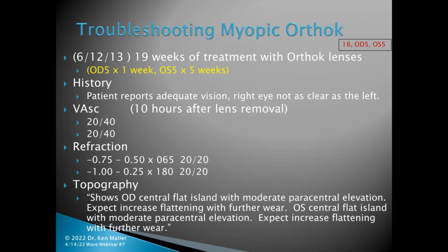Topography shows OD central flat island with moderate paracentral elevation. Expect increased flattening with further wear. OS central flat island with moderate paracentral elevation. Expect increased flattening with further wear.